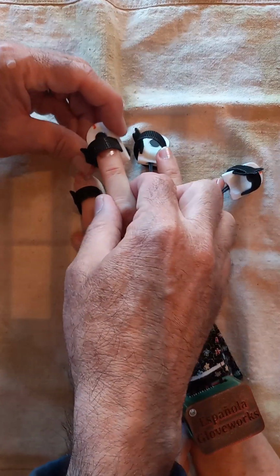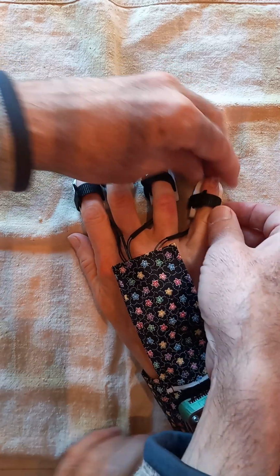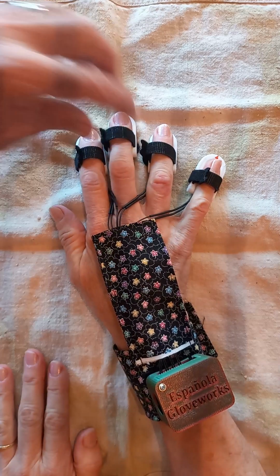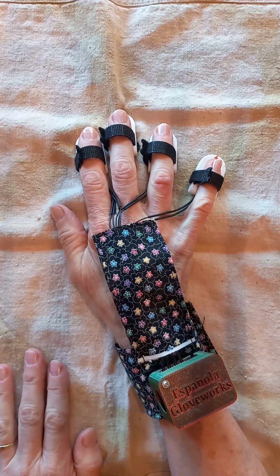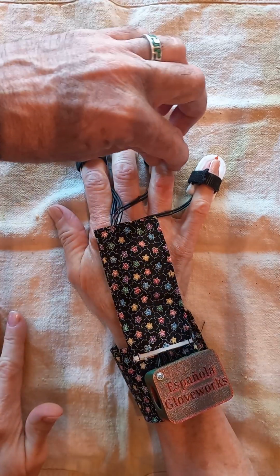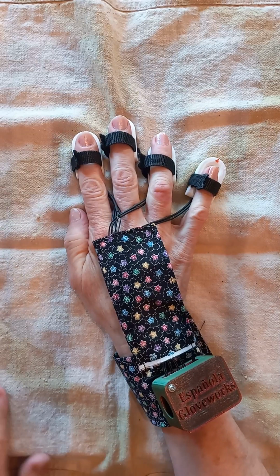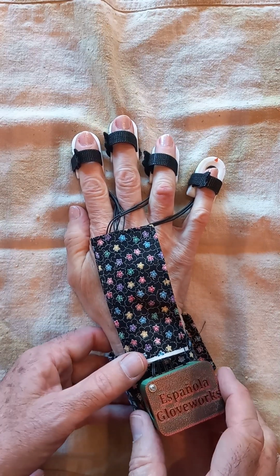1, 2, 3, and 4, and they're cool. How's that feel? It feels good. Yeah? Yeah. And again, the caretaker or yourself, it's not that easy to put on by yourself, especially if you've already got a glove on one hand. So we do highly recommend that someone helps you with this process. But once you get the Velcros at the right tension, you should be able to slide them on and off comfortably. Beautiful. So with the glove on, we can now turn the glove box on.